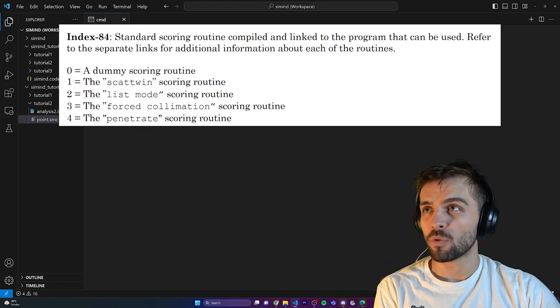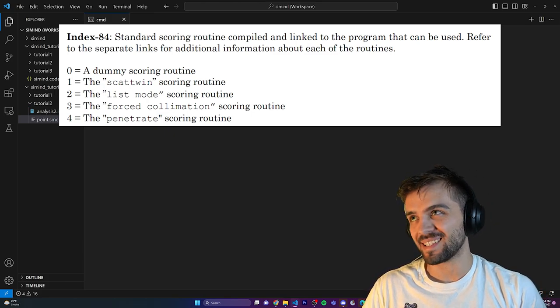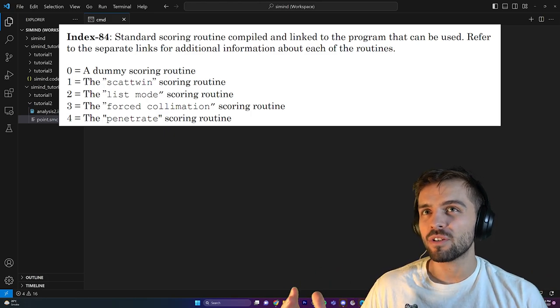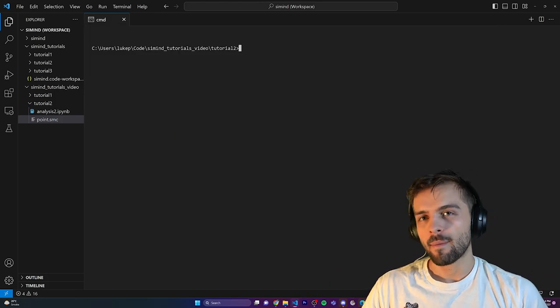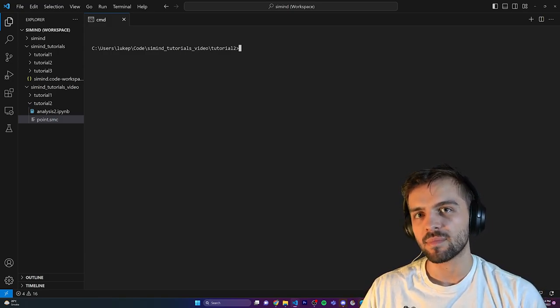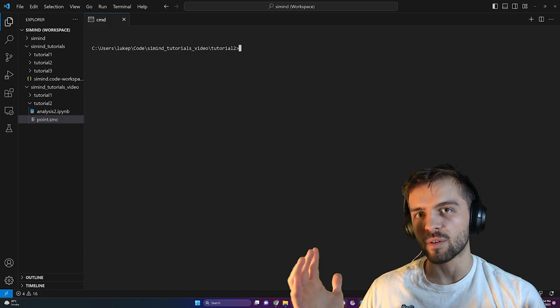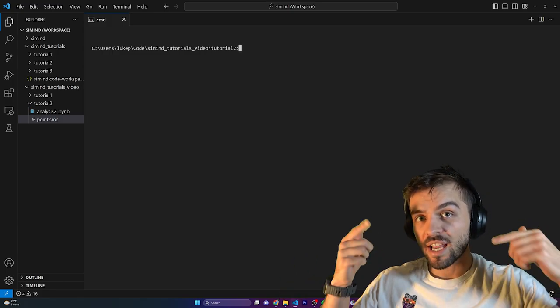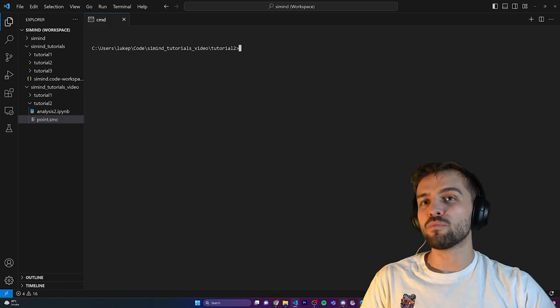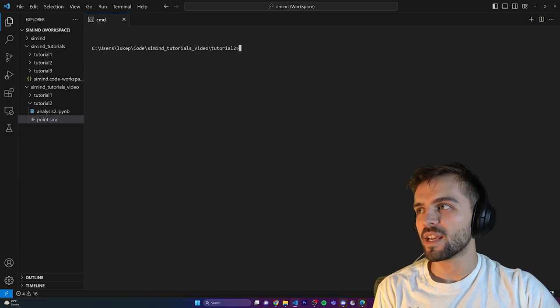The main reason we're looking at list mode is that, while list mode files are very large and not typically used in practice that often, what it gives you is an understanding of a SPECT system that you don't get when you just look at the scatter windows alone. By understanding the SPECT system from that perspective, you can ultimately do more work in the other routine.